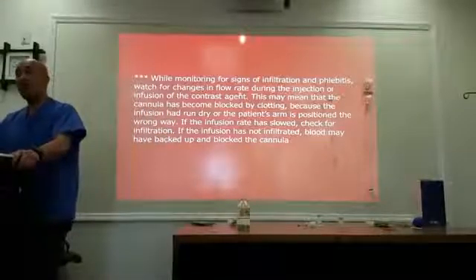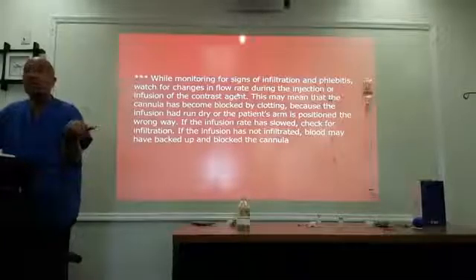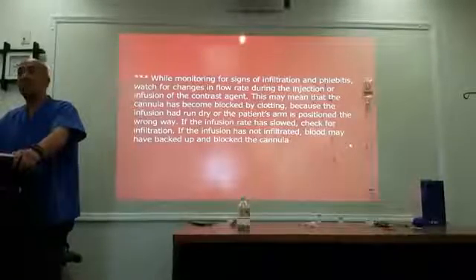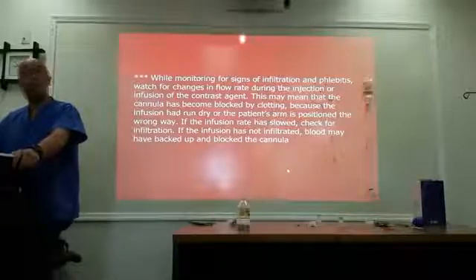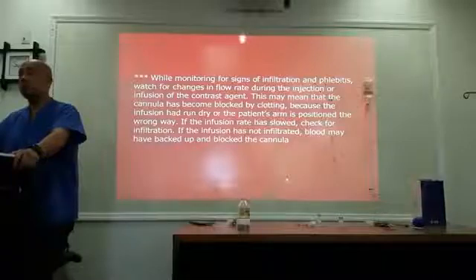But if that's not the problem, then it may be, again, because they moved slightly, the lines may have been kinked. Or, we talked about this earlier, if it sits there for a long period of time, the line itself may become clotted, so of course nothing's going to go through. Or the vein may have collapsed. So those are all different, and you've got to learn how to troubleshoot.